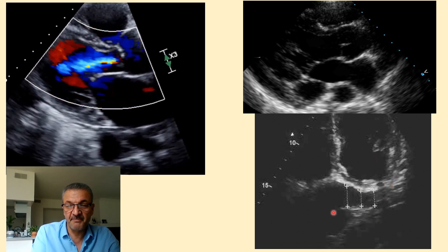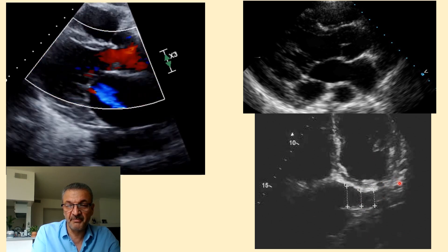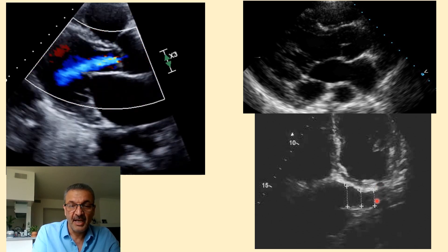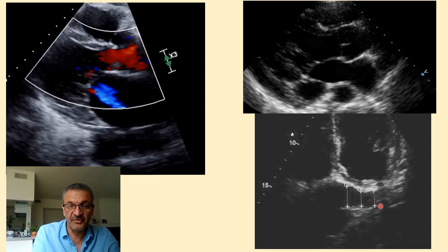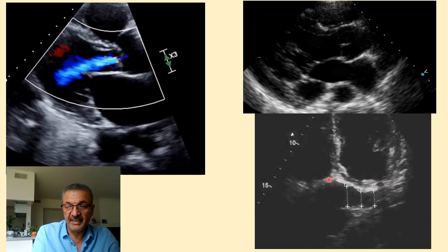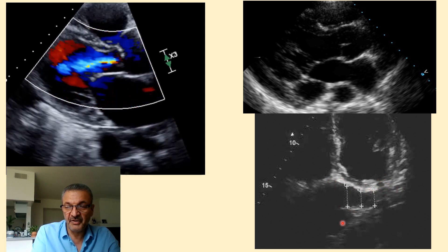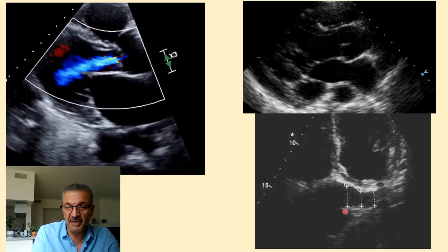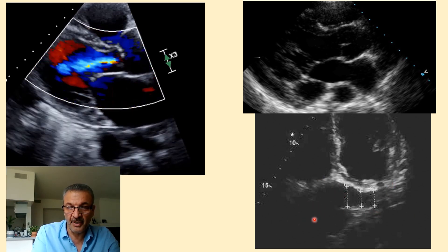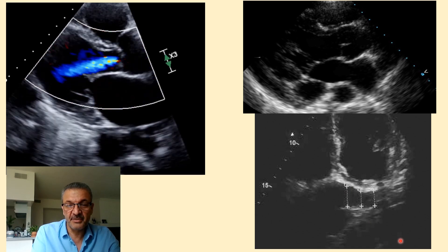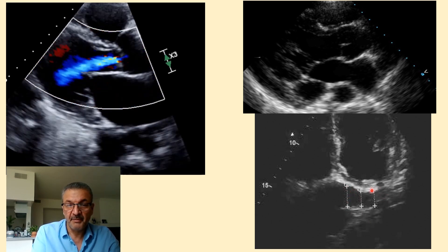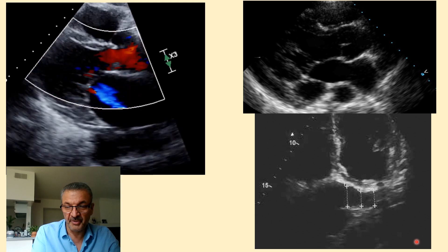Here, as you notice, this is the basal four-chamber view. From a typical apical four-chamber view, you just fan down, and suddenly you will see at the level of the atrioventricular junction a wedge-shaped structure that opens into the right atrium. This is your coronary sinus in the basal apical four-chamber view.